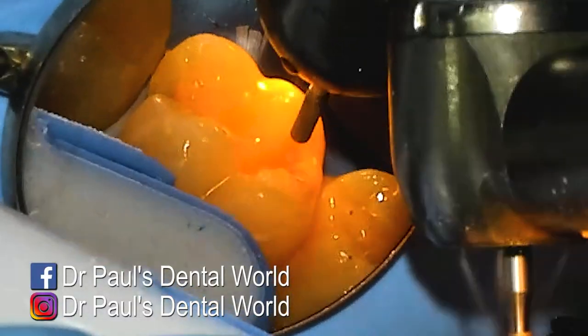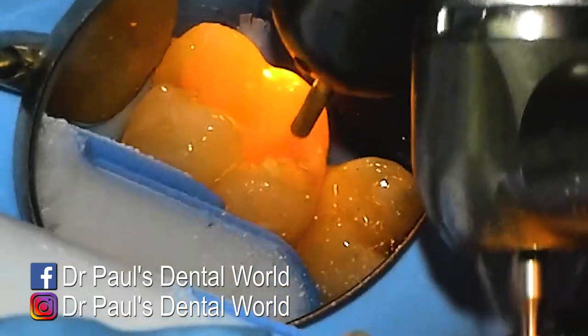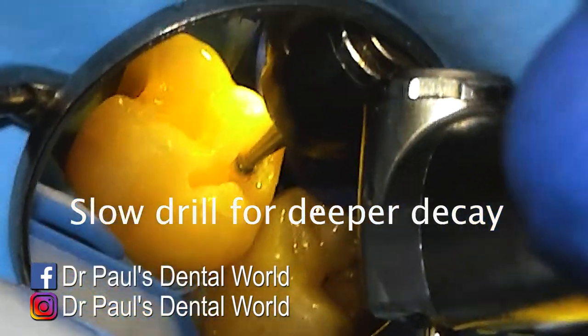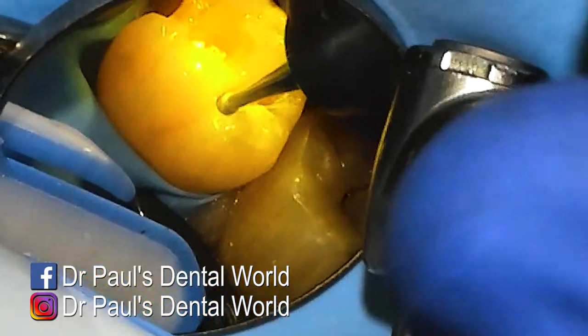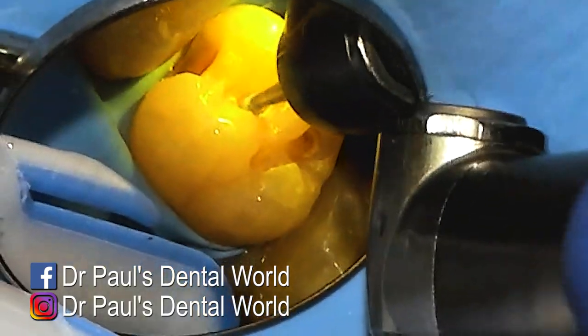Looking at the other areas where there might be some more decay — that bit there had a little bit more, so again I open it up with my high speed to get access to it and then come to it with my slow speed round burr on about 5,000 revs. You can see that chalky powdery stuff — that is the decay — and we're cleaning that out on the back part of the tooth.